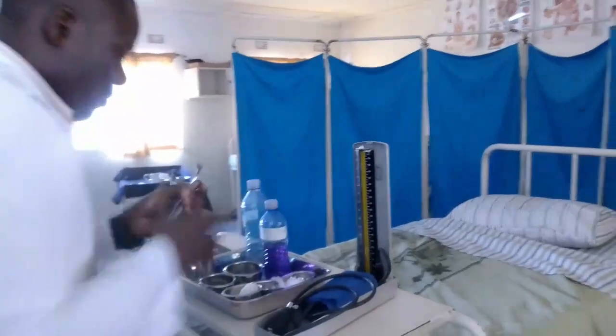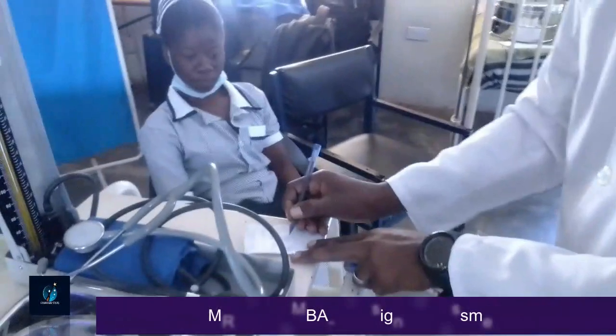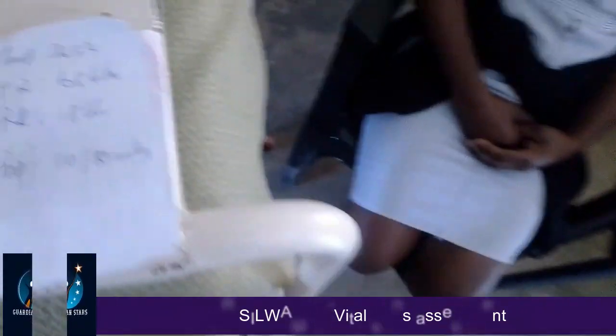swab, and throw. Then here, you need to document again. So blood pressure, it's in blue because it's normal. So it's 110 over 80 millimeters of mercury, which is mmHg. So then I have to explain to my patient that all the vital signs are within normal. The temperature is 36.5, which is normal. Then the pulse rate is 65 beats per minute, it's normal. Respiratory rate 18 breaths per minute, it's normal. Blood pressure is 110 over 80 millimeters of mercury, which is normal.